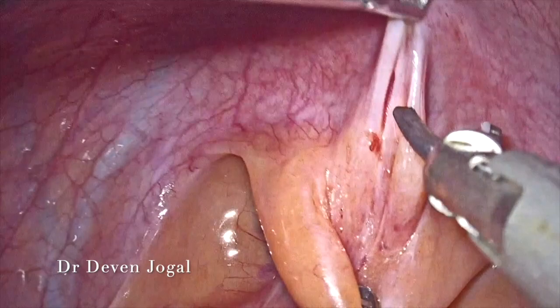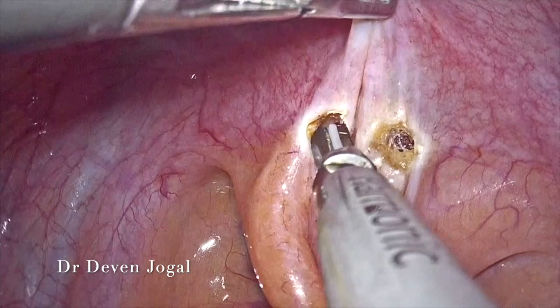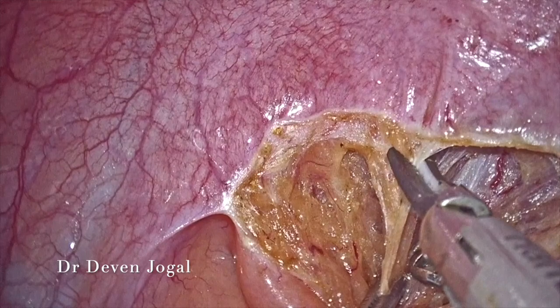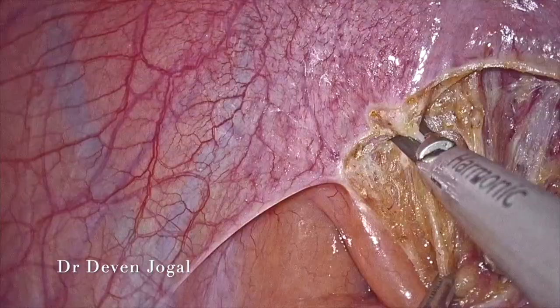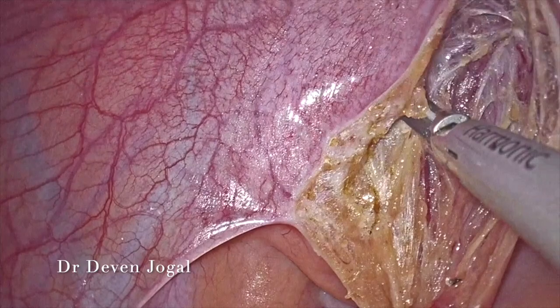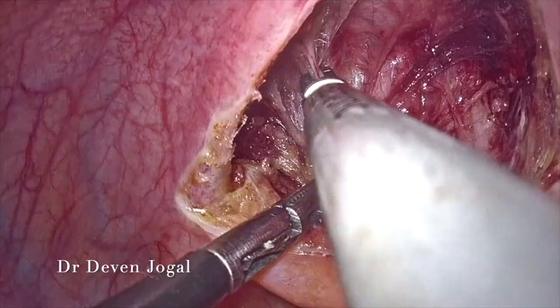As you can appreciate, the fat anteriorly and the vaginal plate — we are dissecting in between this plane. Millimeter by millimeter dissection was carried out, fat being pushed posteriorly, and the so-called recto-vaginal space was developed. At the same time, dissection from the vaginal end was also carried out.